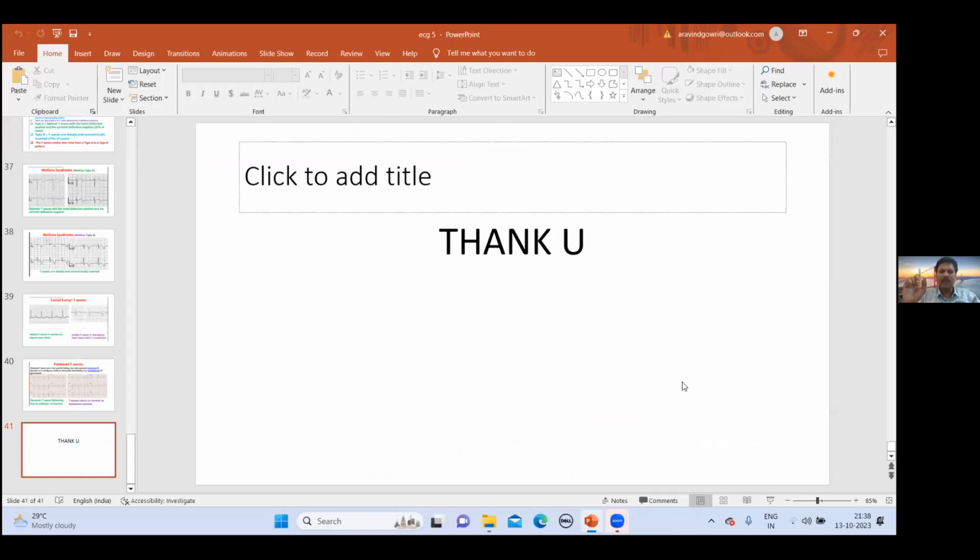I'll summarize very quickly. For the ST segment, you should always look at the J point. If there is rapid J point depression, rapid upsloping ST depression reaching the normal baseline within 1.5 small squares, that is normal. Usually you see this in treadmill testing or in tachycardia.